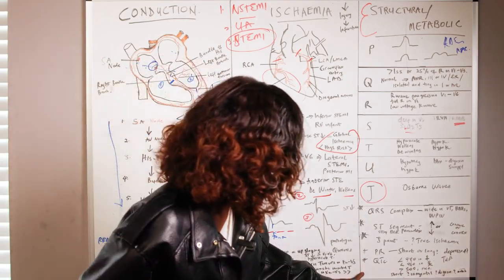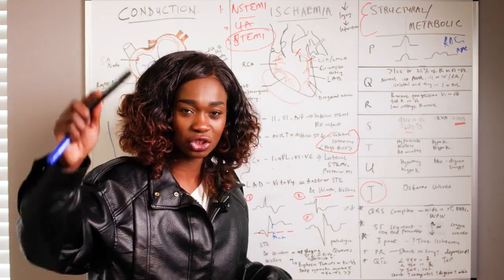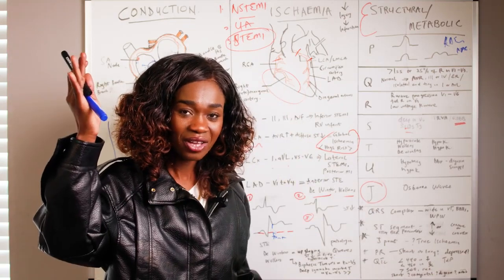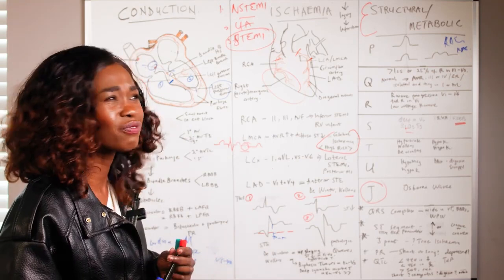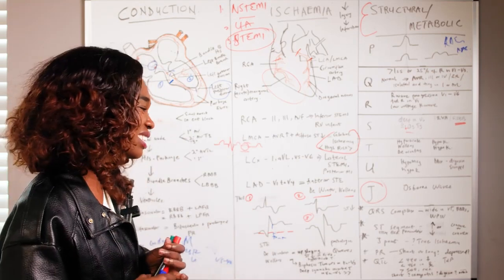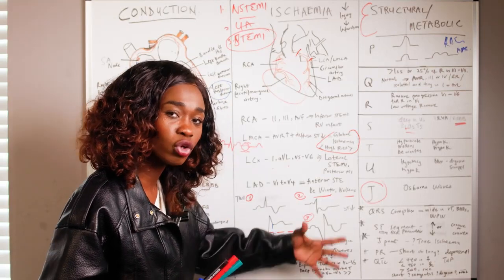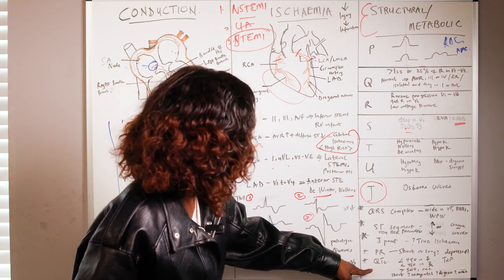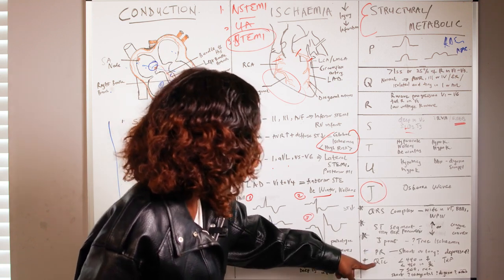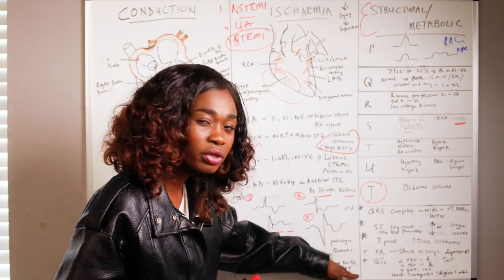Now, don't forget your torsades de pointes. That is where you have, I call it the radio tune. You have oscillating, wide complexes, and torsades de pointes is very important because it's the end point of having hypokalemia, hypomagnesemia, and all your electrolyte abnormalities. So because of that, it is very important that when you notice a long QT, even when the patient is well, you look into their electrolytes, do their blood work.